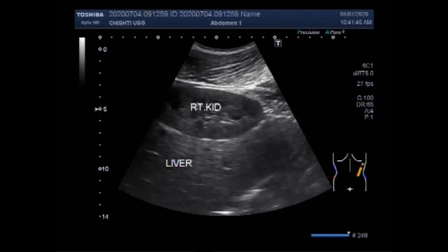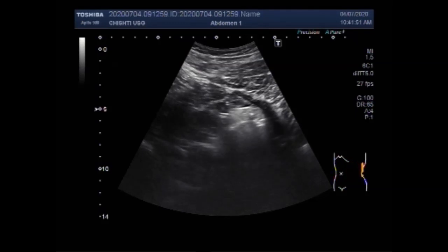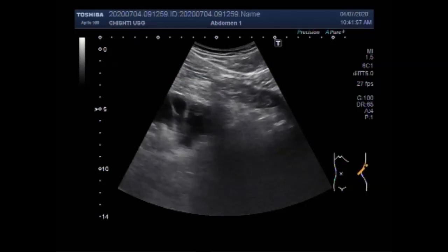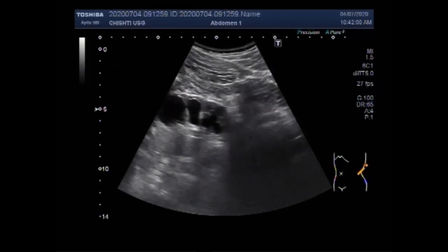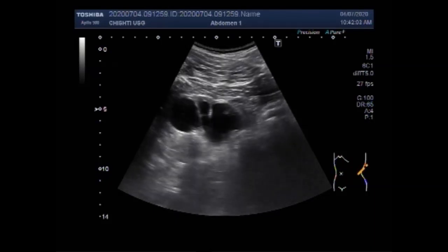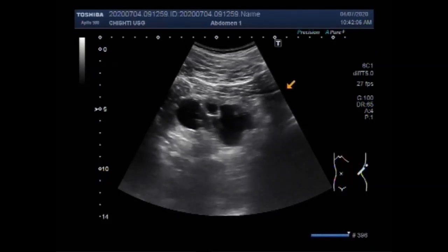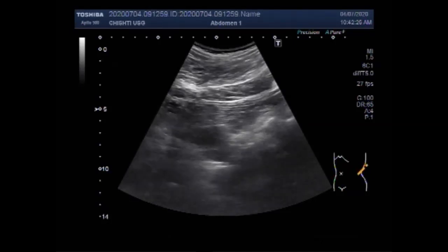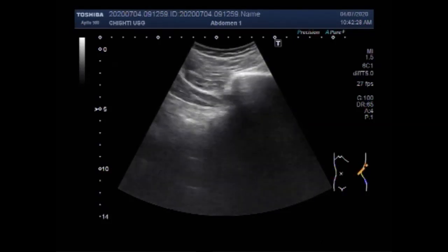The left kidney shows gross hydronephrosis with mild hydroureter and ureteric stenosis at the ureterovesical junction. You can see the kidney and there is loss of kidney function. As you can see, the renal cortical thickness is minimal. The size of the kidney is also reduced due to renal parenchymal disease caused by the ureterovesical stenosis at the ureterovesical junction.